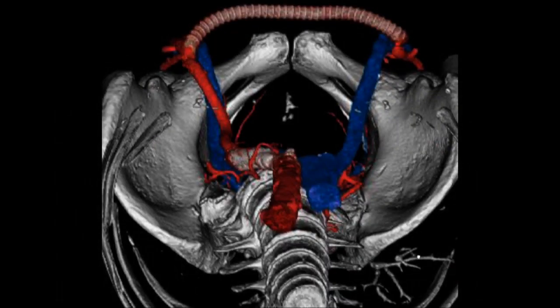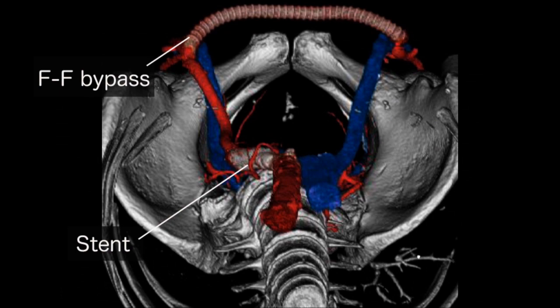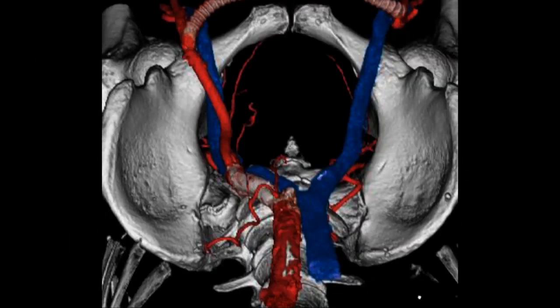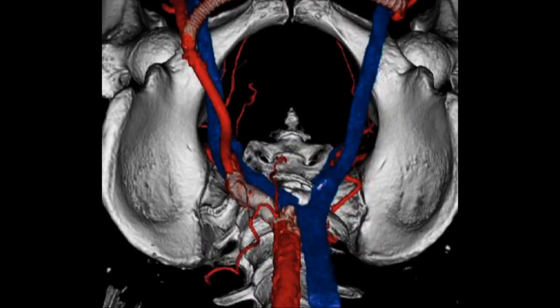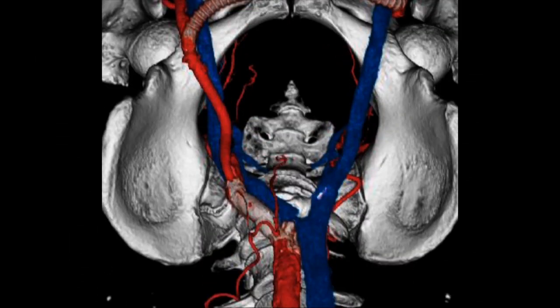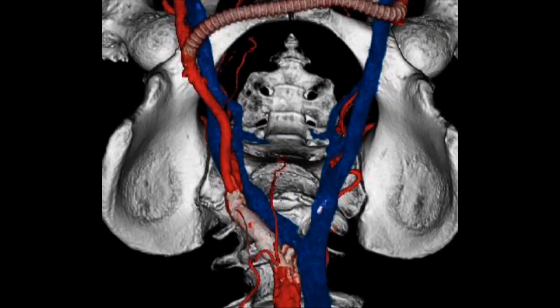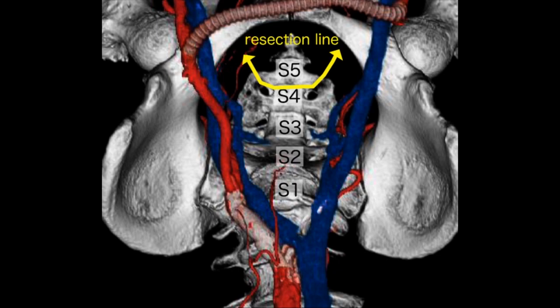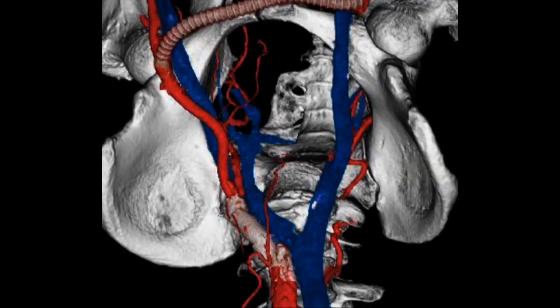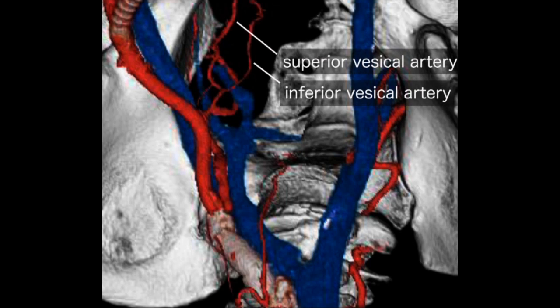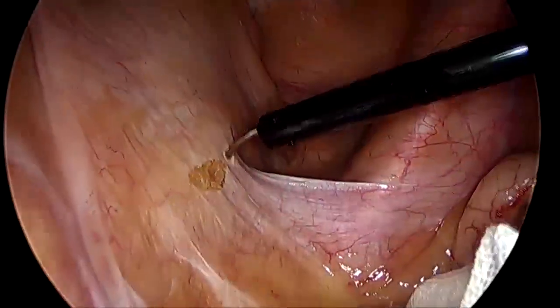This is the 3D imaging. The right-sided iliac arteries are completely occluded, although the left side iliac arteries are maintained. This is the planned resection line of the sacrum. Considering the blood flow toward the urinary bladder, it was critical to preserve the superior and inferior vesicle arteries on the left side.